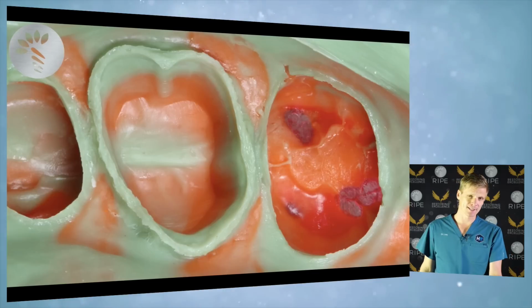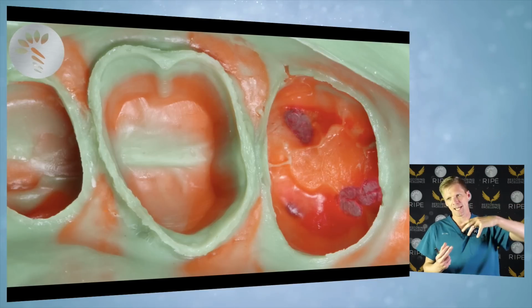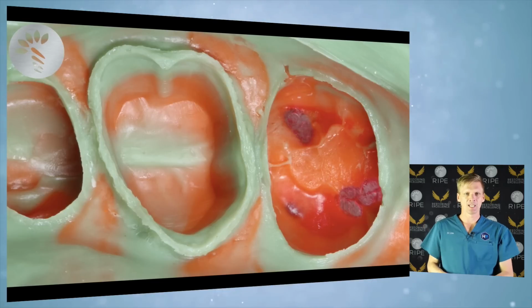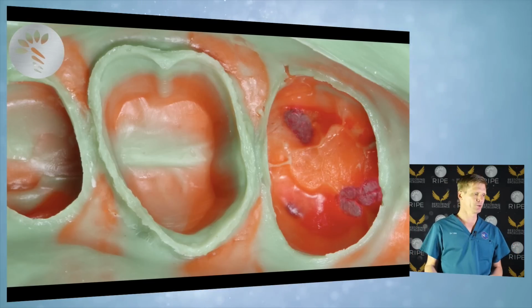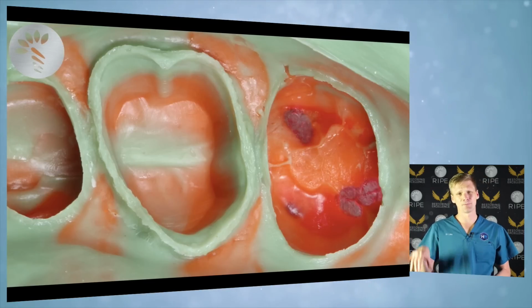Now you go, well, I use a scanner. If you use a scanner, it's very easy for the scanner to pick up. Scanners don't do well with big, deep, narrow holes. They scan very well in big, wide open areas, but they don't scan deep, narrow holes. That's why it's difficult to scan, say, a vertical preparation, because the scanner doesn't see down into a vertical preparation easily.